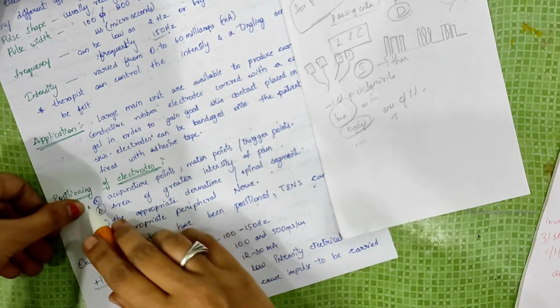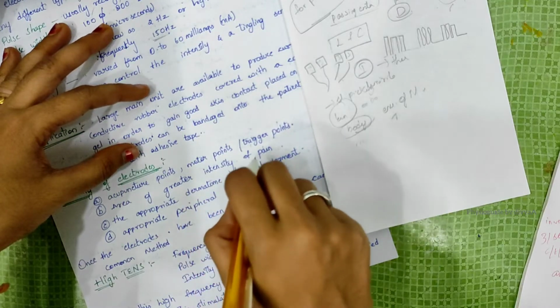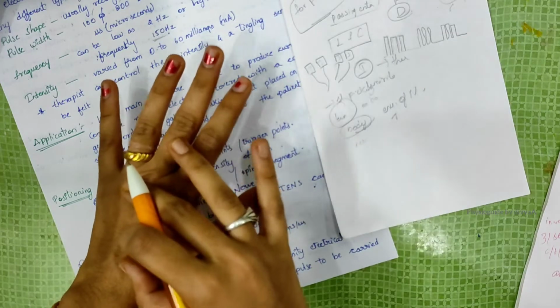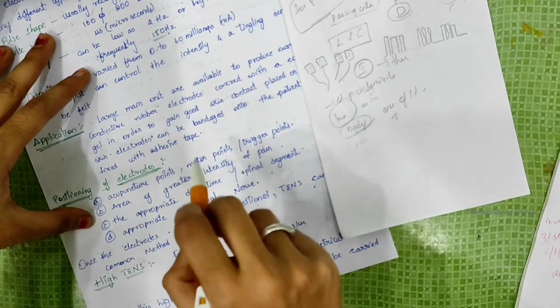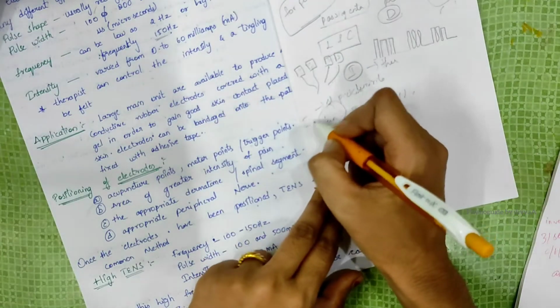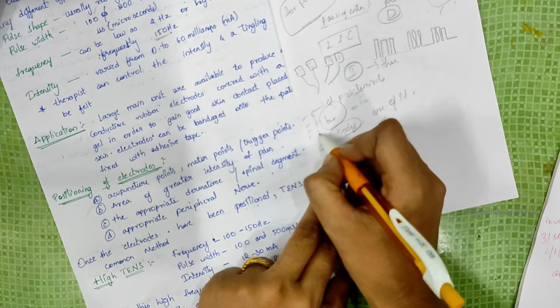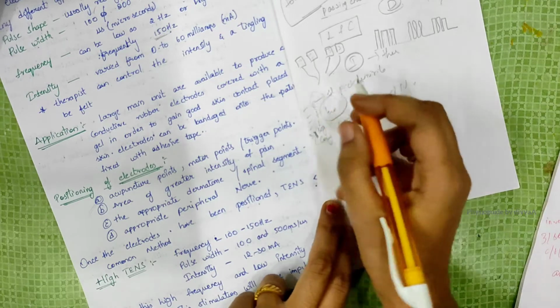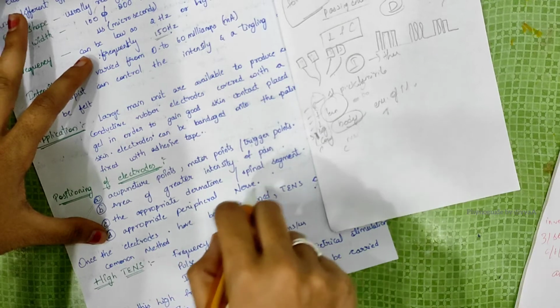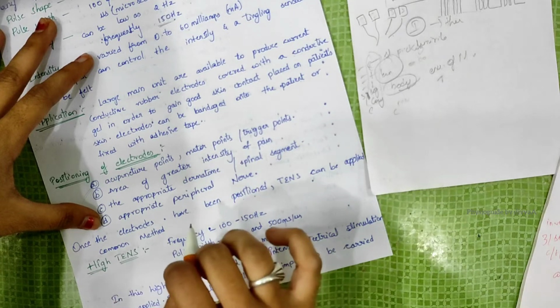In these points the electrodes are to be placed, and also the area of greater intensity of pain, where the patient feels more pain; at the exact position only we can place it, or the appropriate dermatome or spinal segment. Spinal segment means spinal nerve segment, spinal foramen, from cervical to coccygeal: cervical, thoracic, lumbar. And the appropriate peripheral nerve. Once the electrode has been positioned, TENS can be applied by the common method.